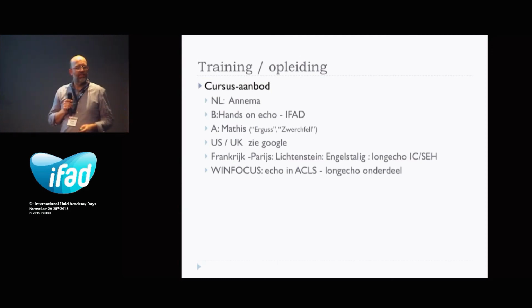What do you make the difference between atelectasis and pneumonia? Well, with the atelectasis you have air bronchogram, it can be both. The atelectasis does not have this C profile. If you have the C profile, meaning black, gray, white, not very well delineated, then you have a pneumonia. All the other things that are smooth is atelectasis. And of course you can have both sometimes. That's more difficult.